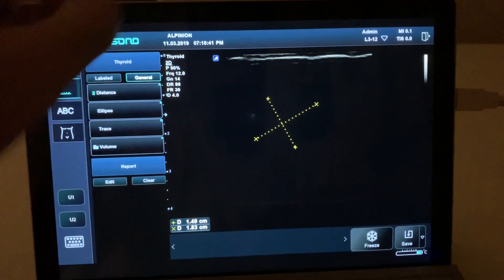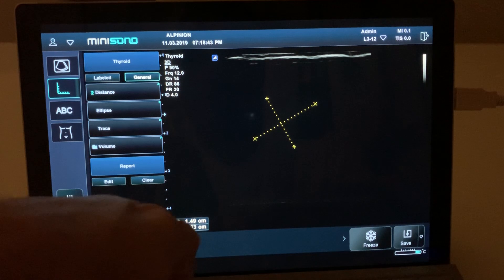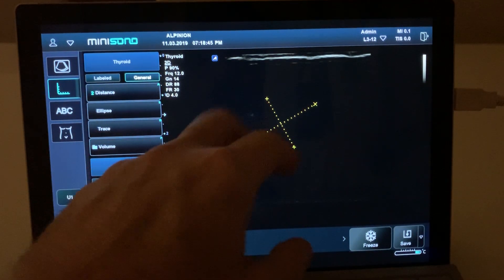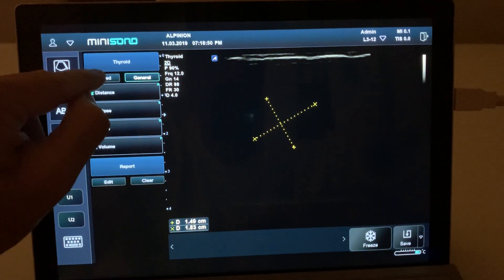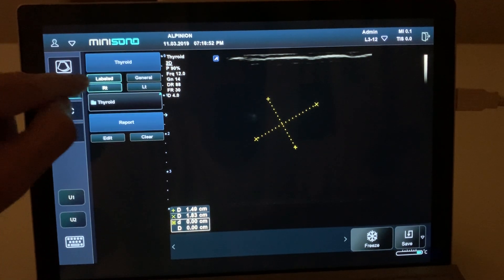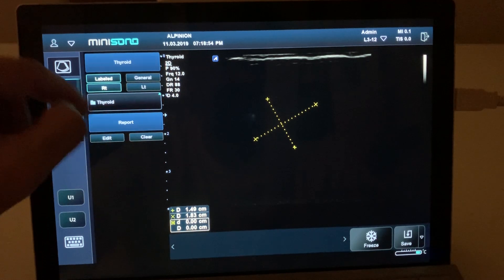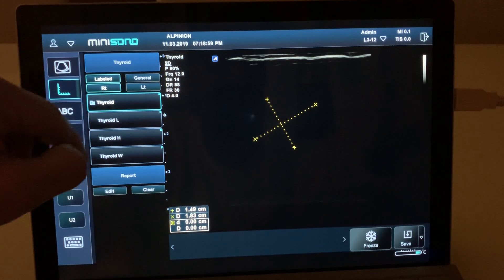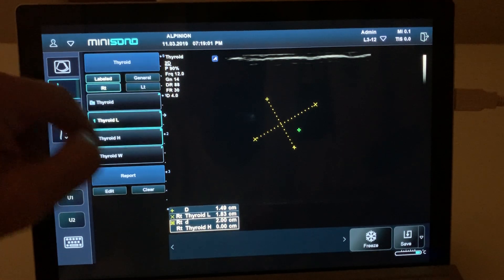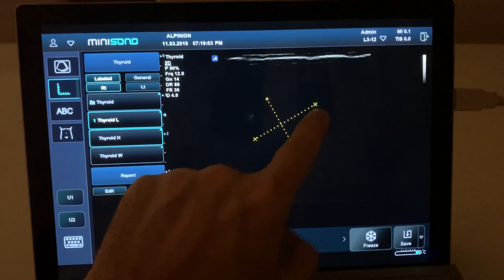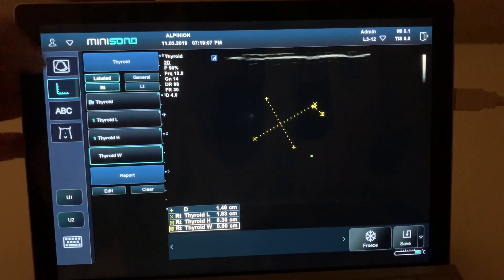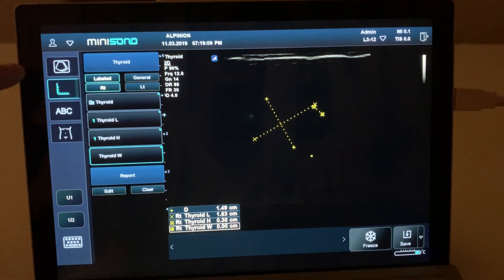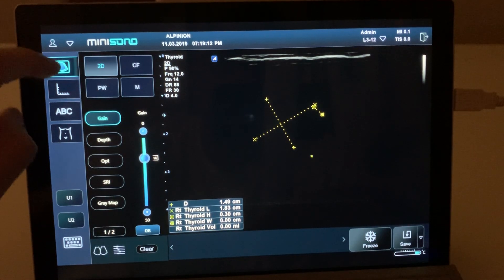It's good to practice this before doing a study so you get used to how to operate the calipers. It also has label measurements — where it says 'label' it will show you some preset label measurements. In this case, thyroid — you'll see thyroid length, height, and width. If you select those you will be able to see those measurements in the report.